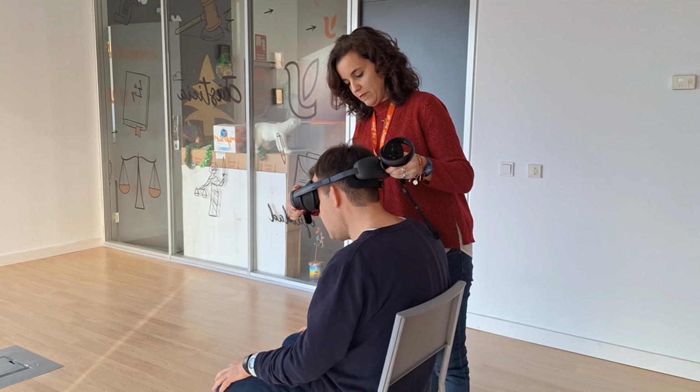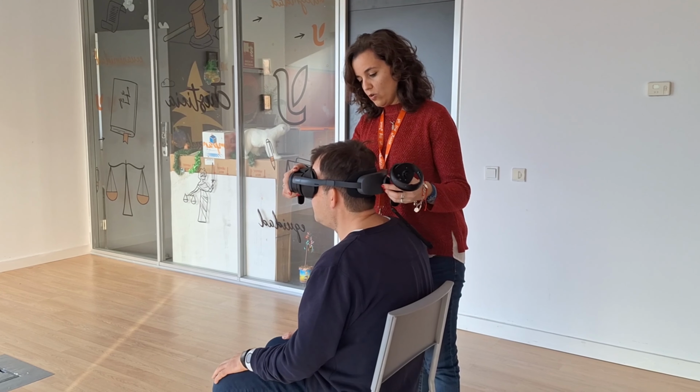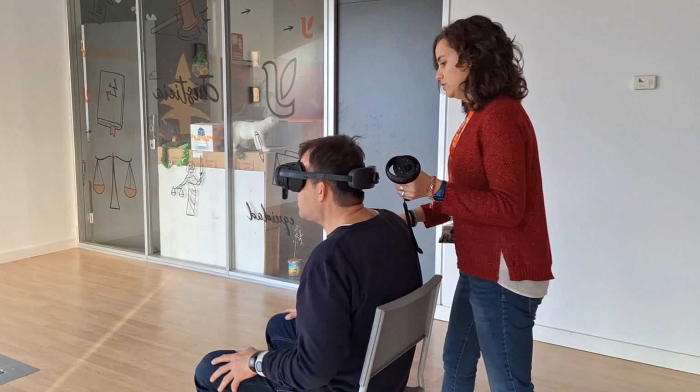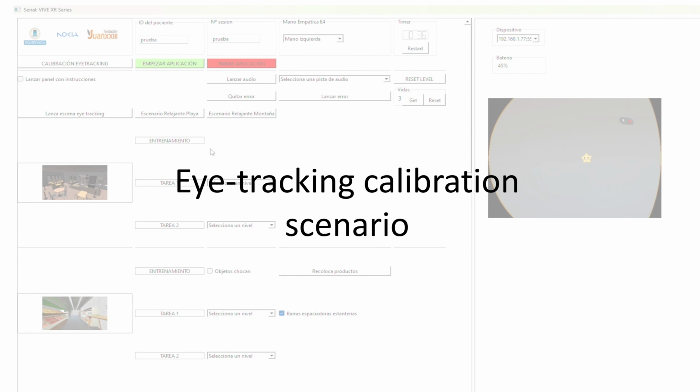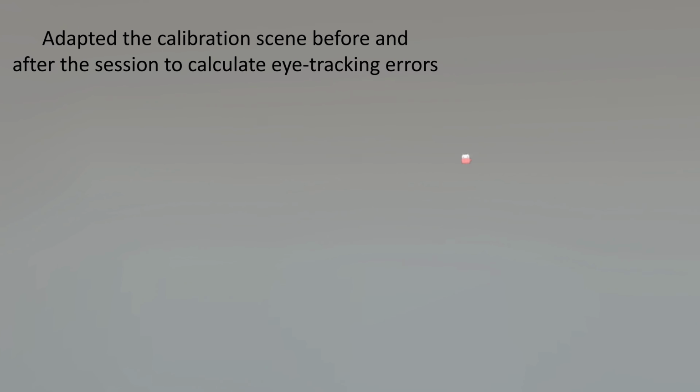Here is a demonstration of a session development. The HMD with face tracker records eye movements and pupil size, requiring calibration. Existing calibration isn't inclusive, as it can't be launched with a control application and sometimes cannot be performed with participants due to error. An inclusive eye tracking calibration scene is added, featuring 6 points in a sphere, and the user has to look at them. With this scene, we are able to calculate the eye movement errors.